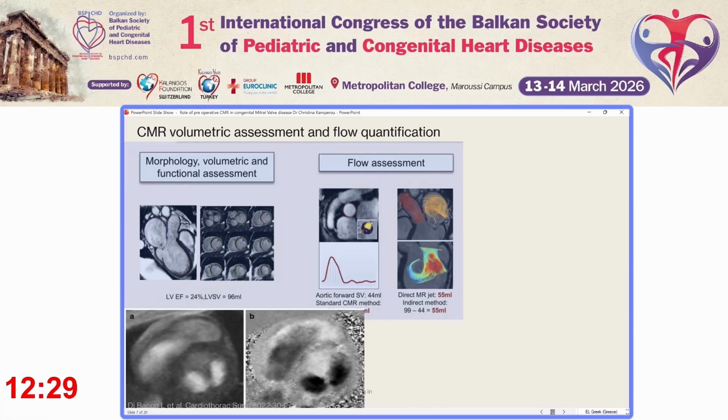However, in patients with intracardiac shunts or complex congenital disease, this approach may not be reliable. Part of the left ventricular stroke volume may pass through the shunt rather than the aorta, meaning the standard calculation can no longer represent only mitral regurgitation, and alternative strategies are deployed, such as comparing left and right ventricular stroke volumes, measuring pulmonary artery flow, and integrating multiple flow measurements with anatomical findings.